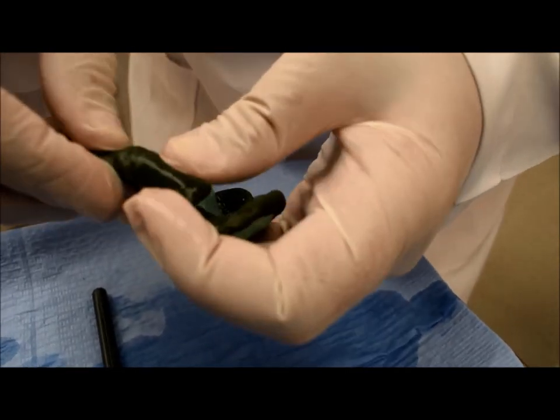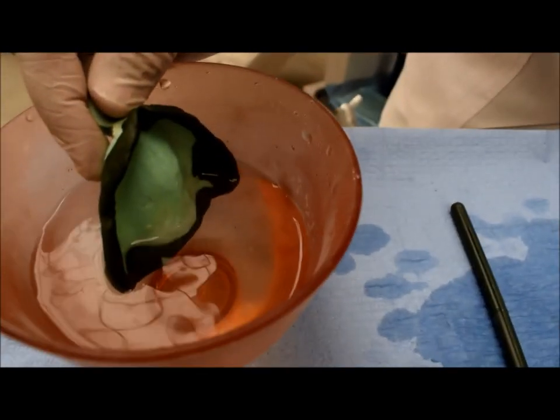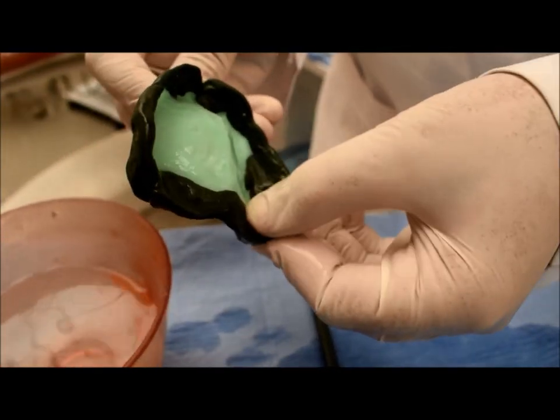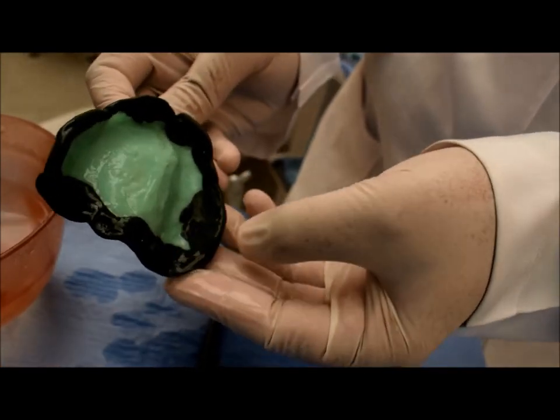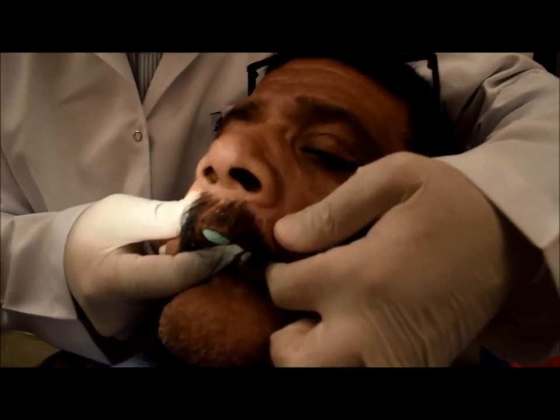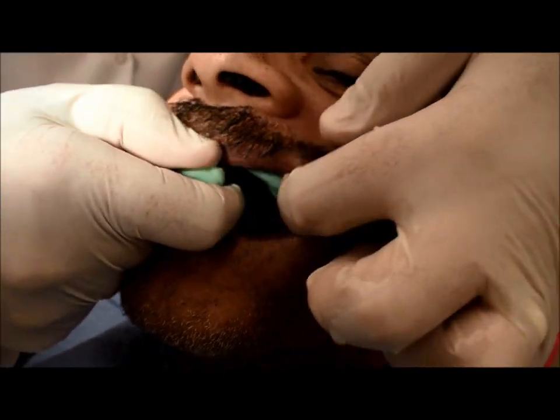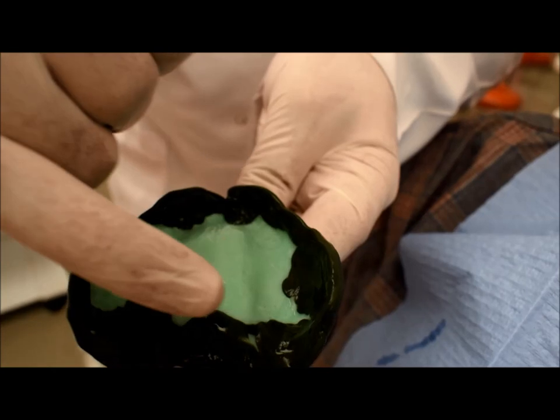I take the green stick compound and apply it on the tray in a horizontal orientation, then insert it into the hot water. I seat the tray and ask the patient to swallow to activate the muscles of the soft palate. I check that the compound on both sides covers the hamular notch areas, wait till the material hardens, then break the seal and remove the tray. The compound records the post dam area and the hamular notch areas.